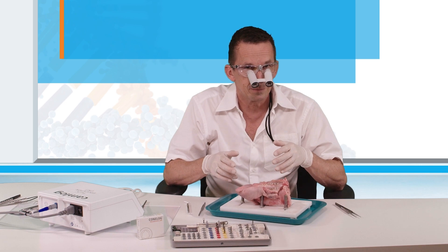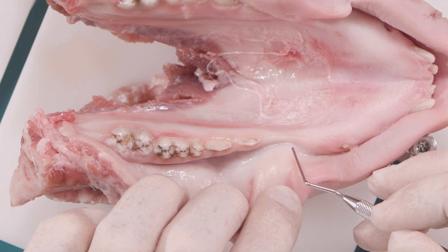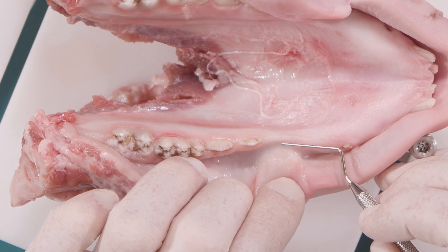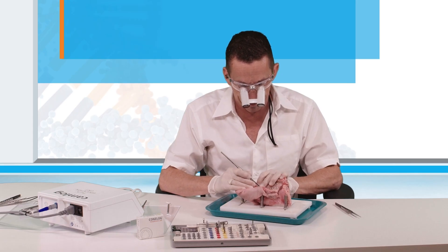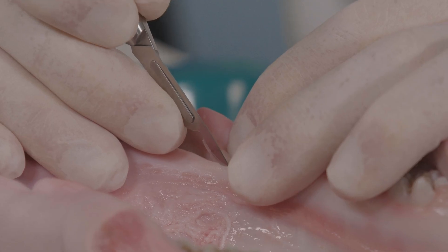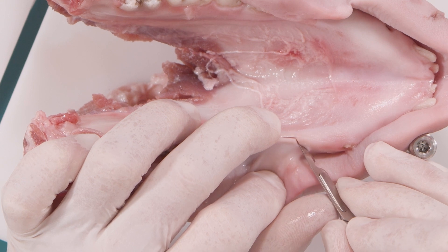Let's have a look at how this surgery can be done at the pig jaw model. Here especially in this area I can show you the advantage of this surgery. In this area you have less keratinized mucosa because of the movable gingiva and movable mucosa. We want to increase the attached gingiva during implant placement, which means we should move this part more to an apical position. We start with the crestal incision line down to the bone, then proceed with a vertical releasing incision, staying in the keratinized mucosa.